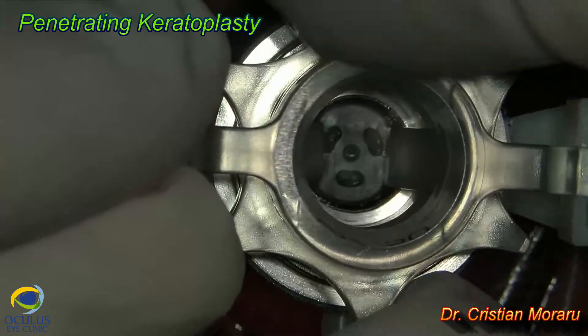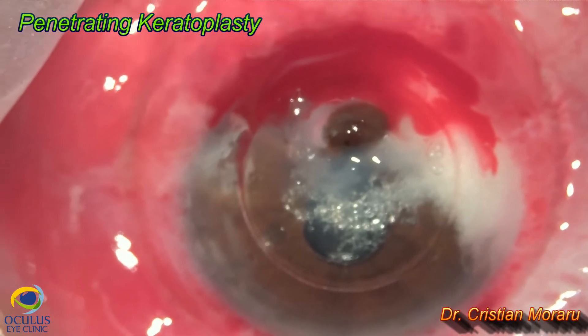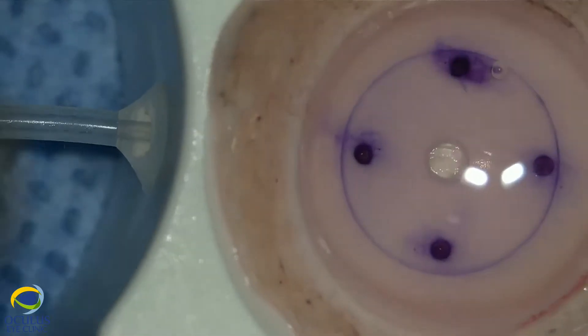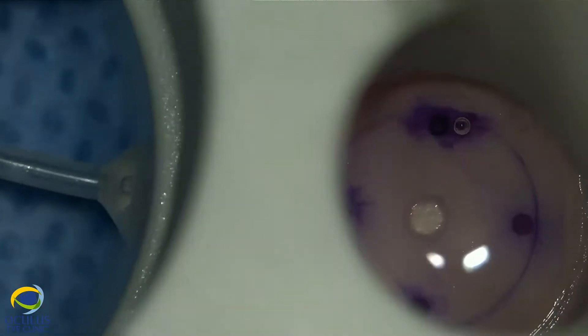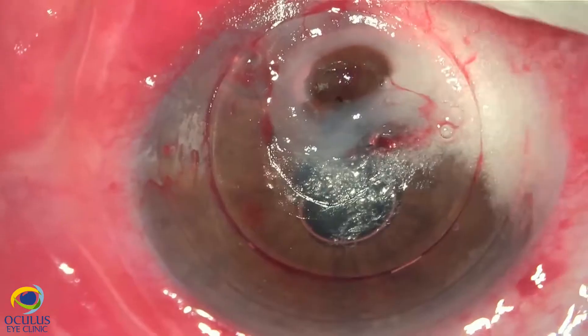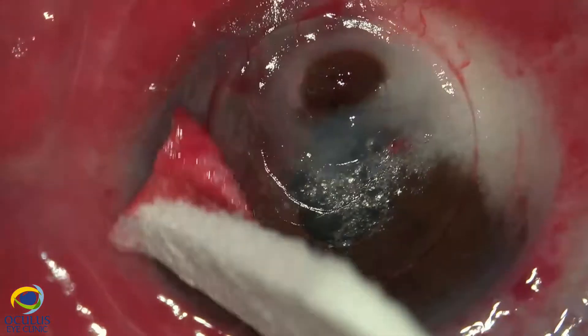We performed penetrating keratoplasty using a Moria trifine, aiming for a slightly inferiorly de-centered trepanation because we wanted to completely cover the area of perforation. The graft is prepared after we measure the diameter of the area which needs to be eliminated.